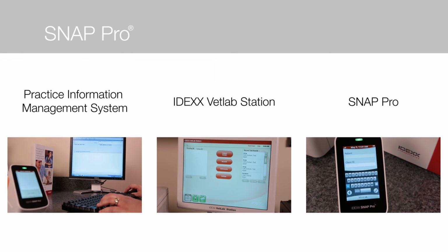If the Snap test run was started at the Practice Information Management System, once you select the checkmark, the results will then be sent back and stored in your Practice Information Management System. If the Snap test run was started at the IDEX Vet Lab Station, once you select the checkmark, the results will be sent back and stored in the IDEX Vet Lab Station. If your Snap test run was started directly on the Snap Pro, once you select the checkmark, the results will be stored on your Snap Pro. The last 100 Snap test results will be available to be viewed on the Snap Pro Results tab.